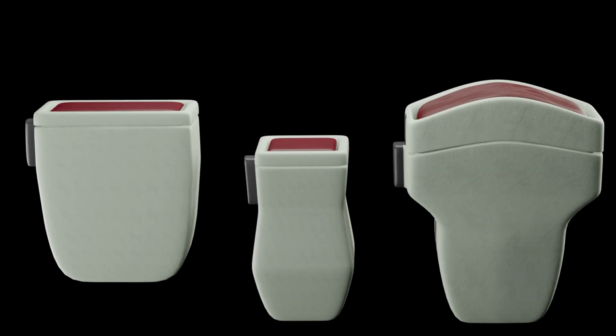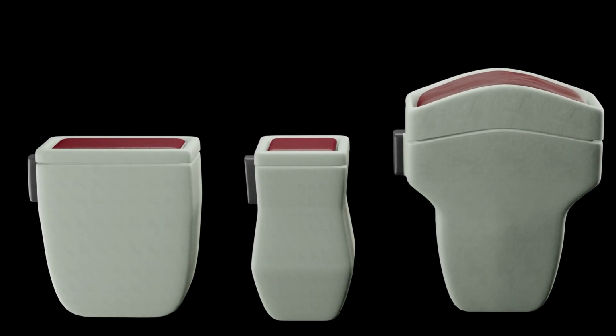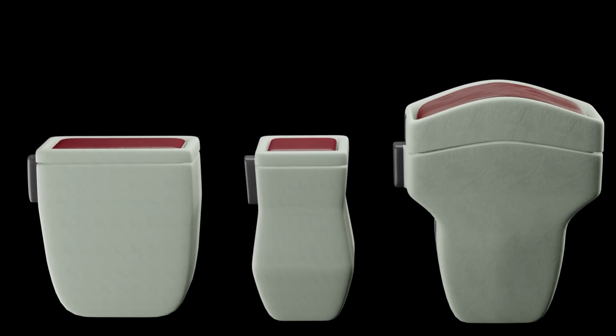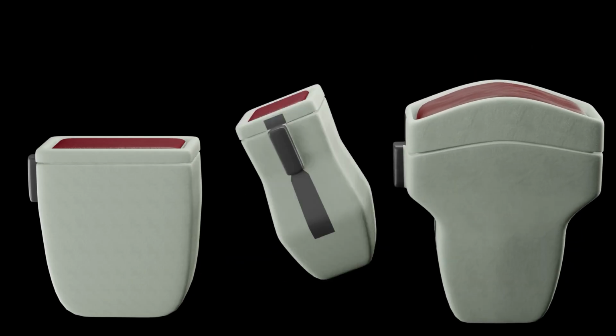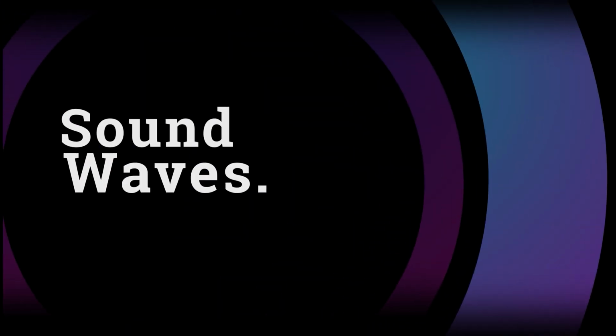To start, a common theme is choosing the correct probe. We have 3 ultrasound probes in front of us. These have different frequencies for different applications. Some of these are small and square, others are thick and bulky. There's a reason behind these designs. But before we can start classifying what they can be used for, their advantages and disadvantages, we need to get some understanding on the basic physical properties of ultrasound.